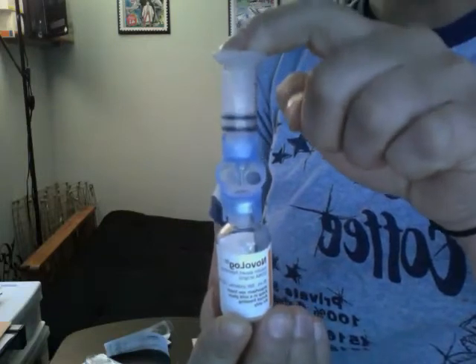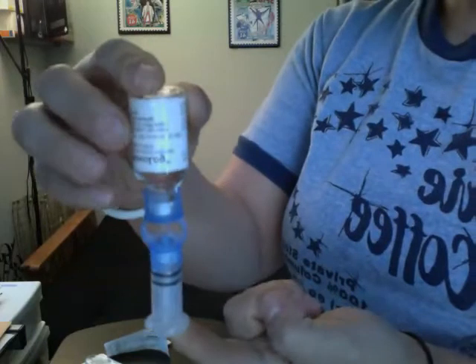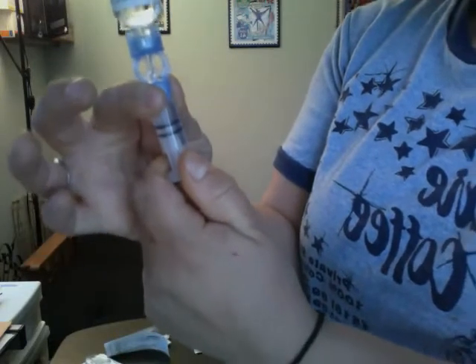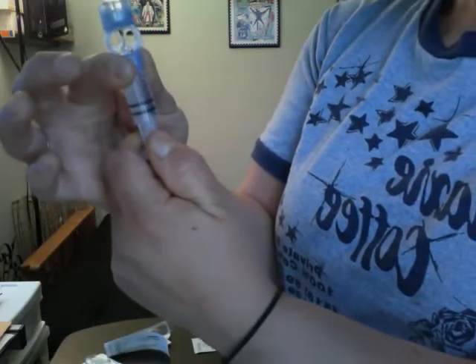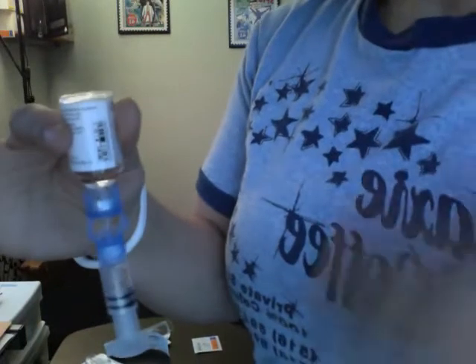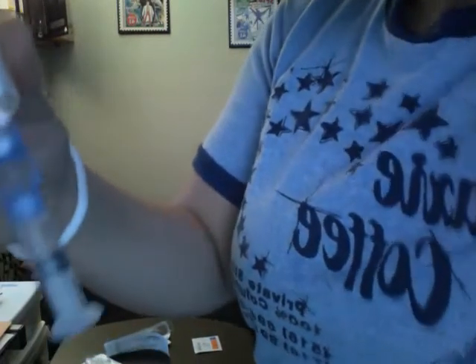insert all the air, hold the plunger down, flip it upside down, and now withdraw out the amount of insulin I need, which is 1.4 milliliters. And do this slowly. The warmer the insulin is, the less bubbles you'll get. So the colder, the more bubbles, and that's the slower you have to go.